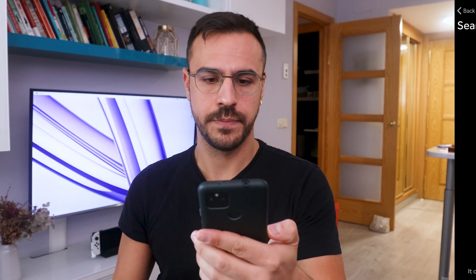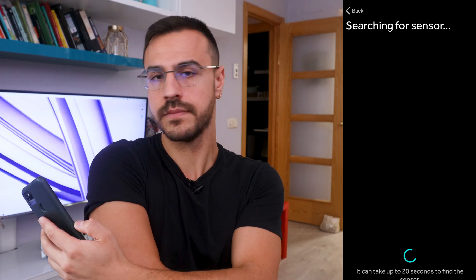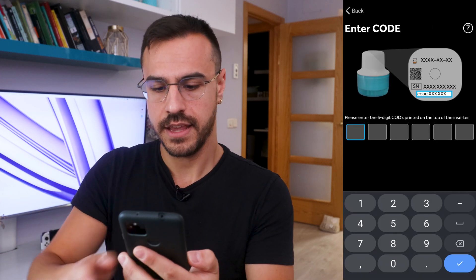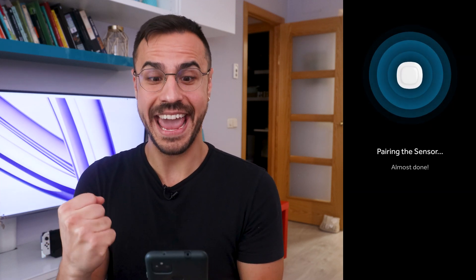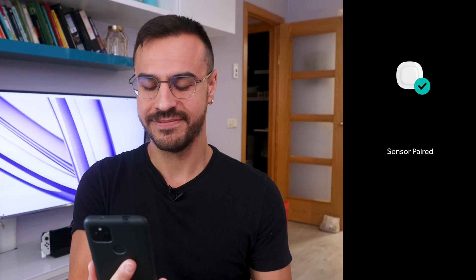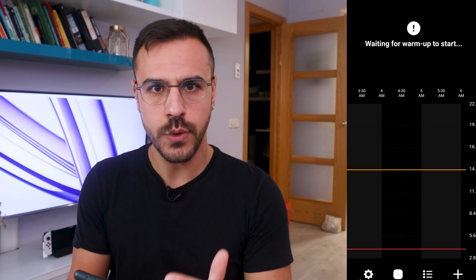That was simple — that felt like Simplera. It is searching for the sensor. It found it. That was fast. Once the serial code pairing is done, the sensor is paired. We are warming up. This is a two-hour warmup, which is a bit long, but I've got my other sensors on so I'm not worried about having readings. Let's see how this week goes.